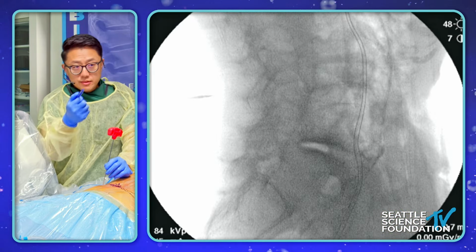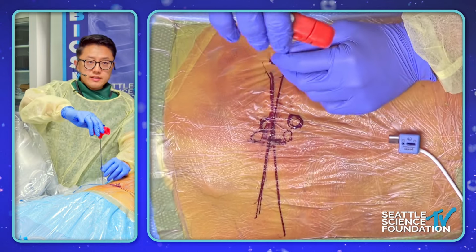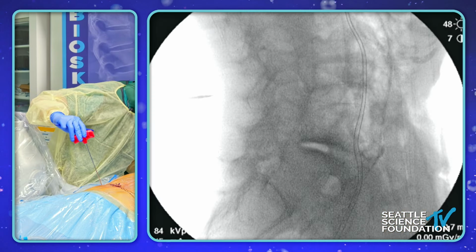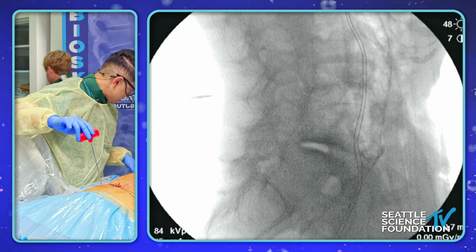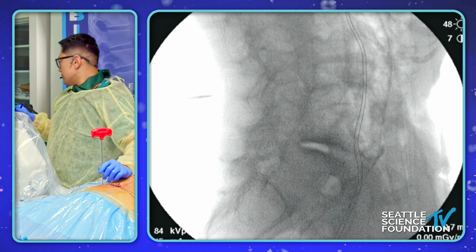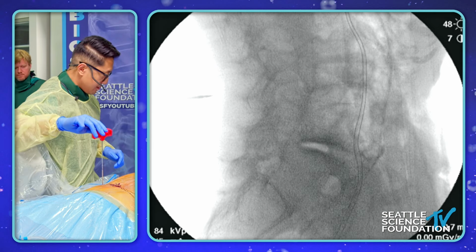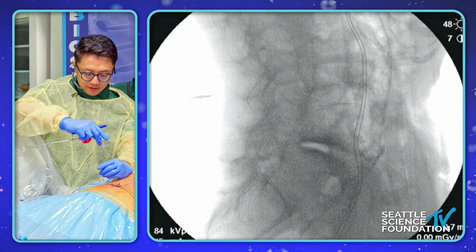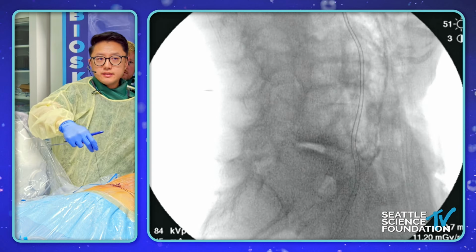That's what we talked about earlier with the slide up on the actual talk. Can you use a different instrument? We were not able to see that on the X-ray. Yeah, we can use it. You can use any instrument that you want. Use the pusher, the pusher works well. Do you have a regular spinal needle? Give him the yellow or red pusher. You can use essentially any instrument that you want here. So you could do the same thing. If you were doing this traditionally without this long Jamshidi needle, let's take a shot there. You do the same exact thing, right?